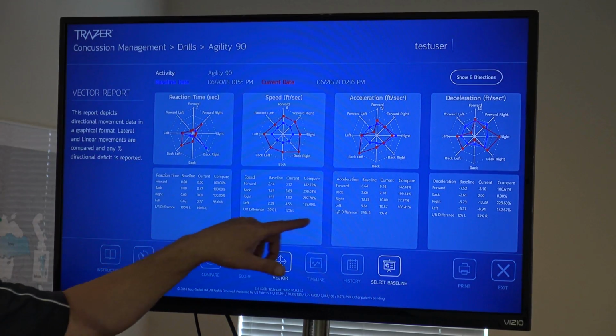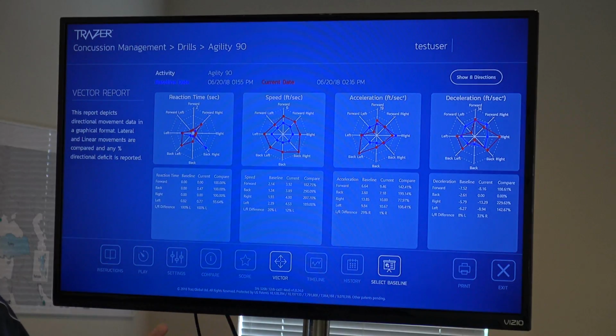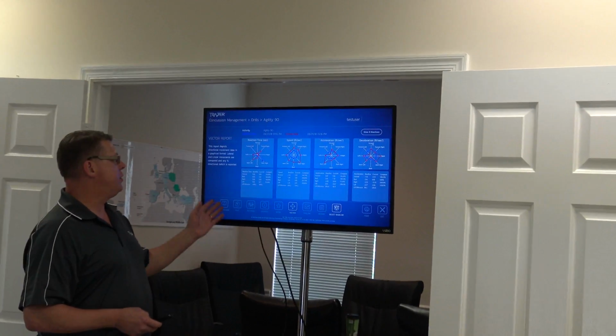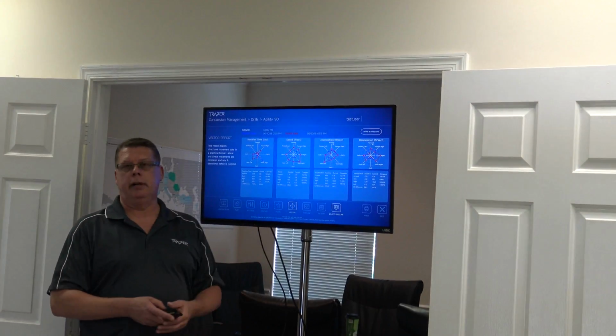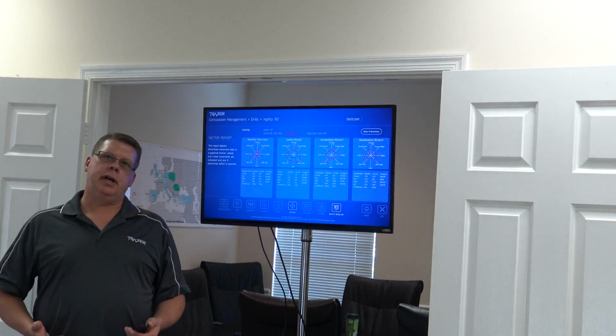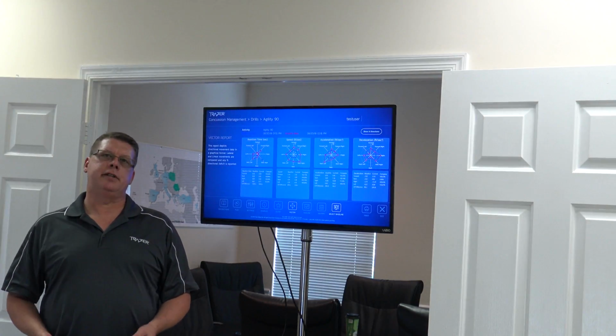And then again, it provides asymmetry of movement from that previous point in time to the current point in time to determine if a person's asymmetry is decreased, thereby making them less at risk for injury, or is increased. This is also helpful from a PT's perspective. Normally, when somebody experiences 20 to 30% asymmetry after an injury, the pain has disappeared.